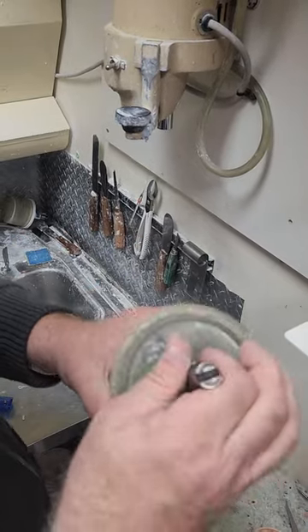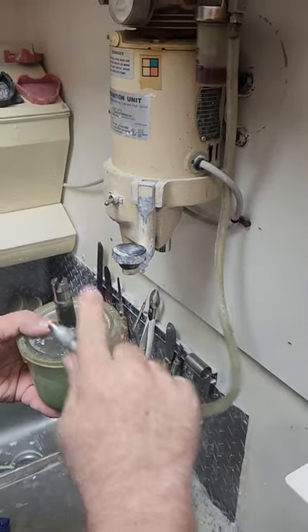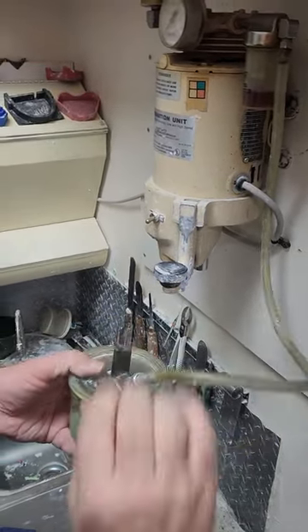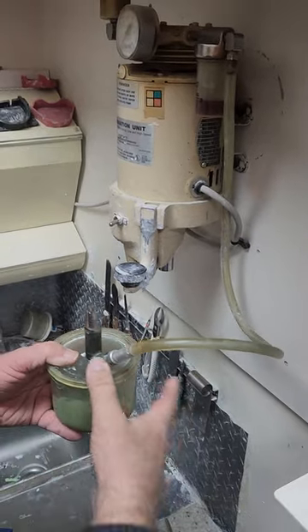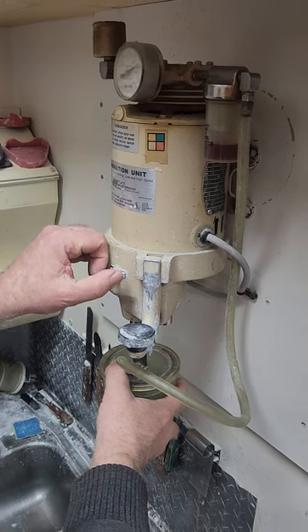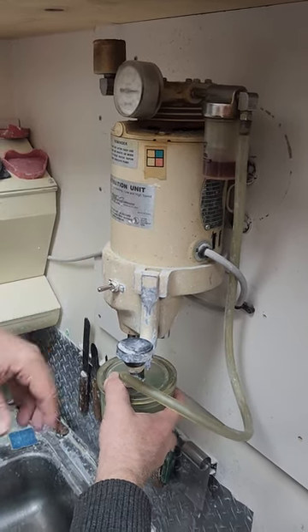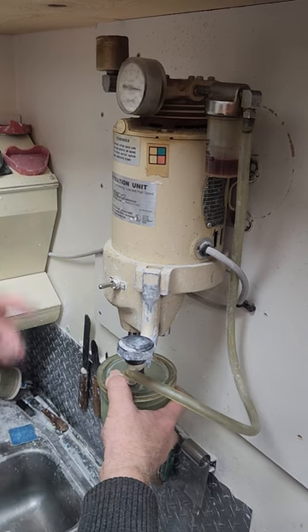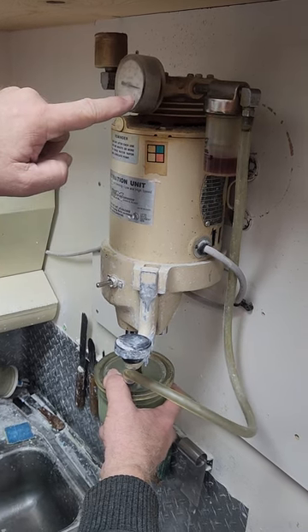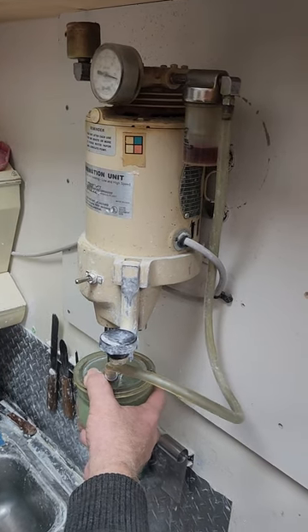Now we're going to put this over the top. This is a Whitmix vacuum mixer. We put this in and it's going to create vacuum. We'll put it right into place and then turn this switch to the on position. When you take it off, it'll still continue to suck.